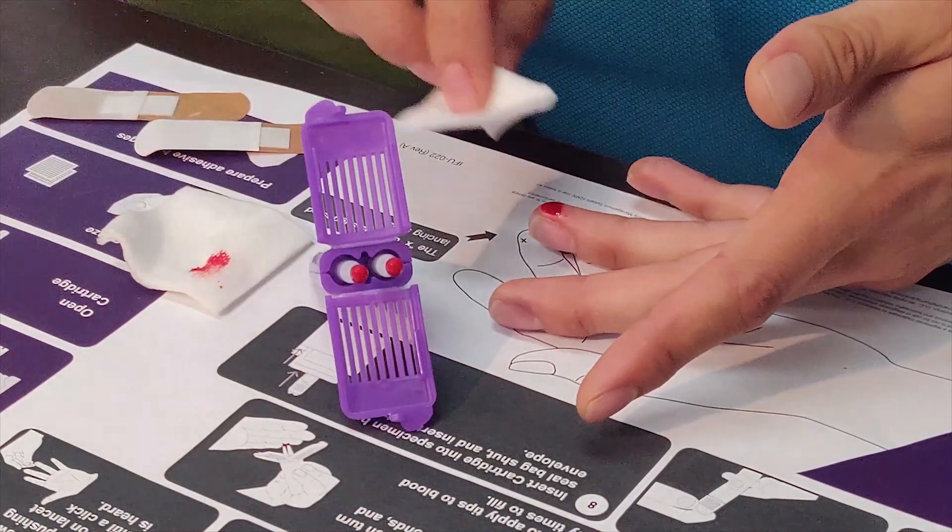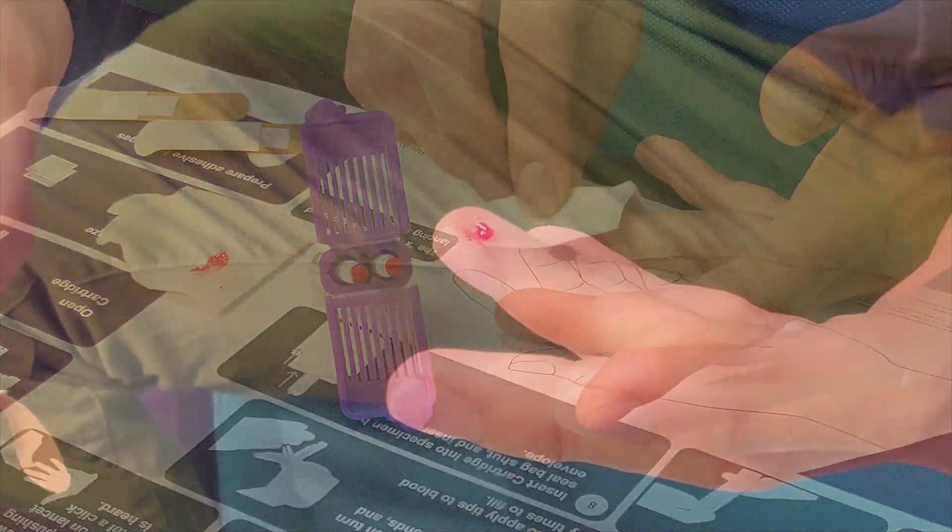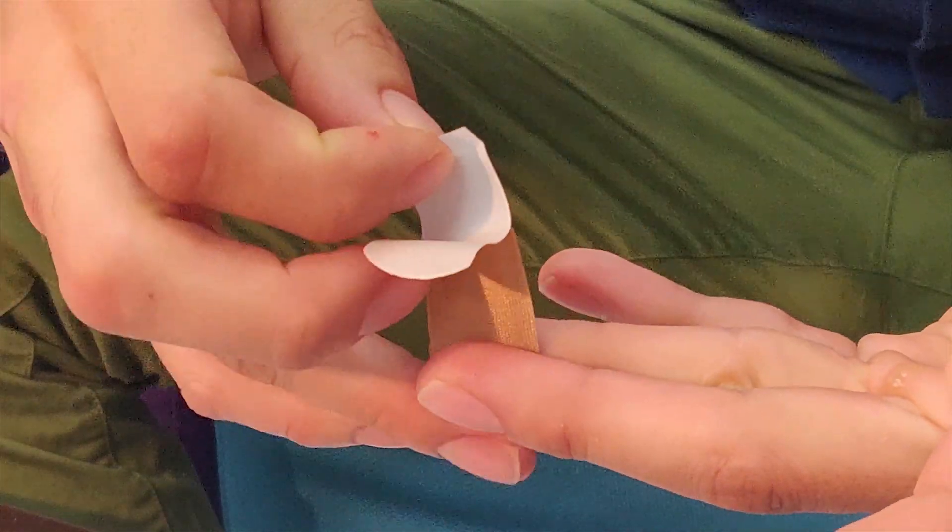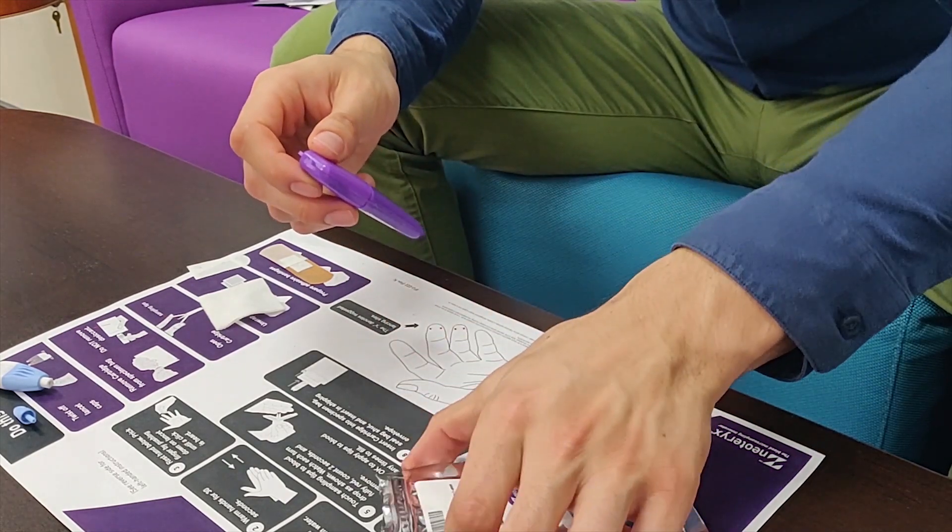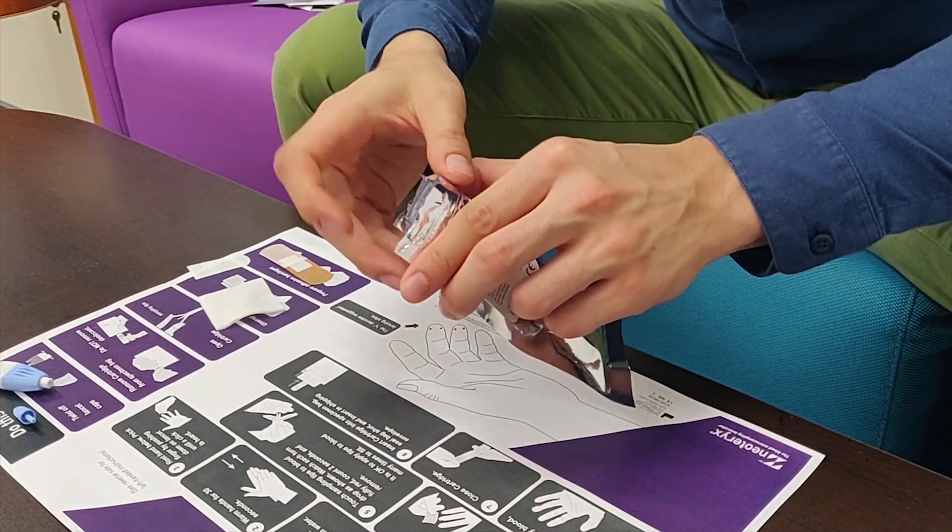Put down the device. Use the gauze to wipe away any excess blood and bandage your finger. Close the Mitra device and place it in the specimen bag with the desiccant. Seal it shut.